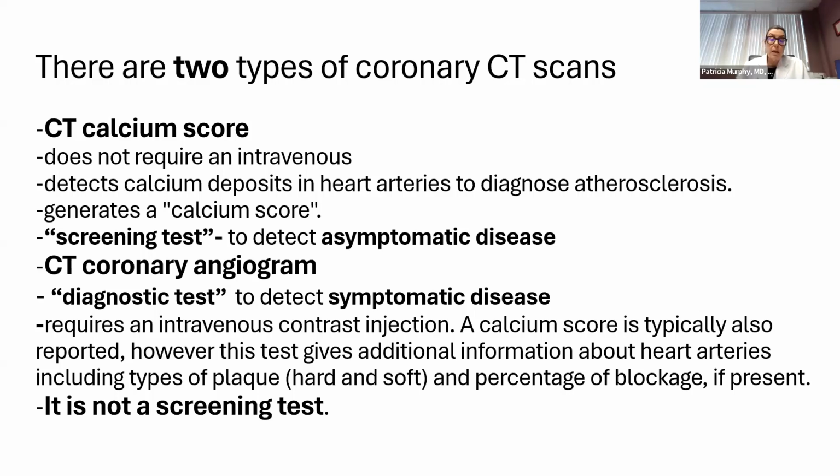And again, it's not a screening test. We don't do the CT coronary angiograms in asymptomatic people these days. This may change with time, but this is the current recommendation.